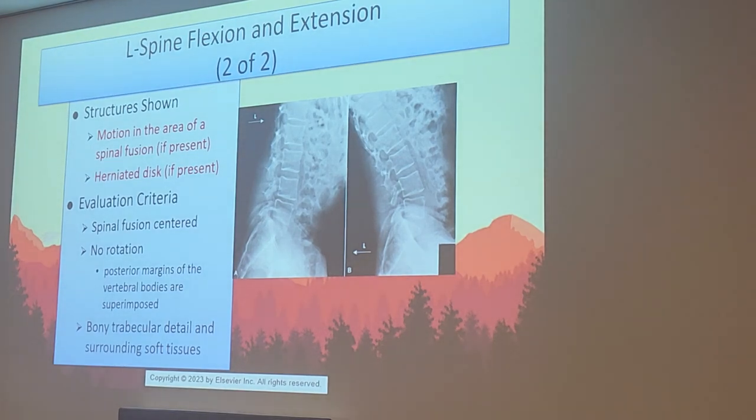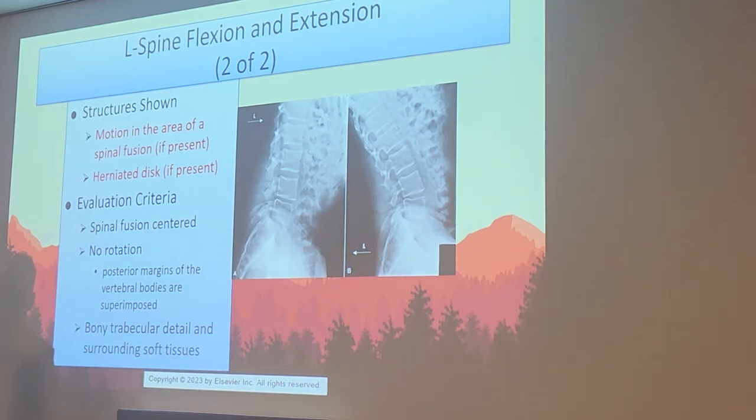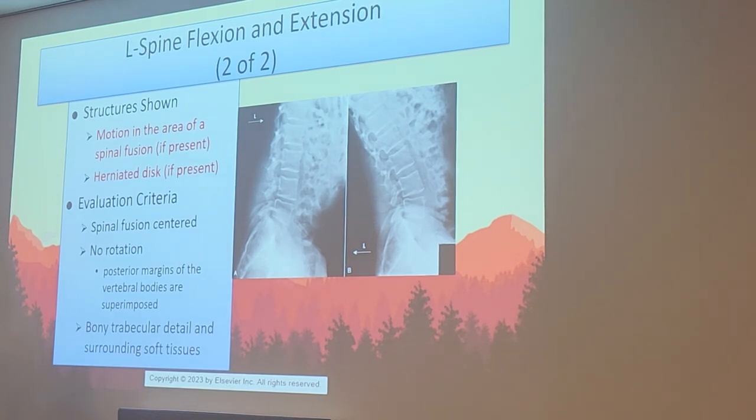All right, so what do we want to see, guys? If there's any motion in the area of spinal fusion, in other words, if we see the vertebrae shifting between the flexion and extension, that means that the fusion is not complete. There's been an error. So we're going to look for what we call motion, especially the vertebrae shifting, or we're going to see if there's a herniated disc. Once again, if a spinal fusion is present, that's where we want to be centered. The rotation as usual, and proper flexion and extension is what I have to add. Being properly flexed, properly extended.